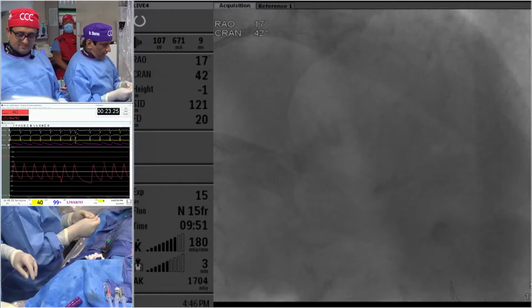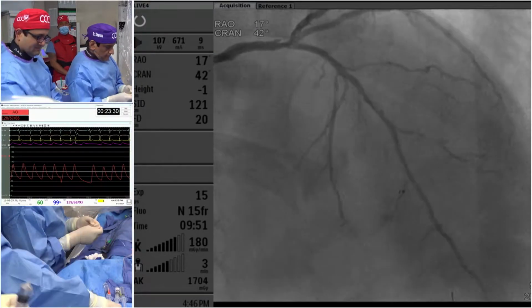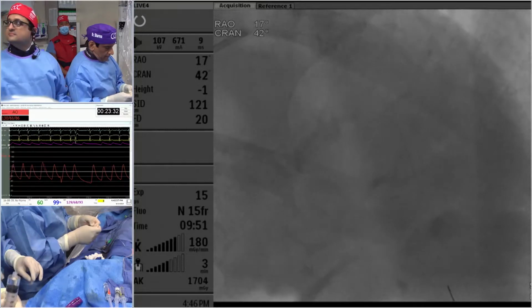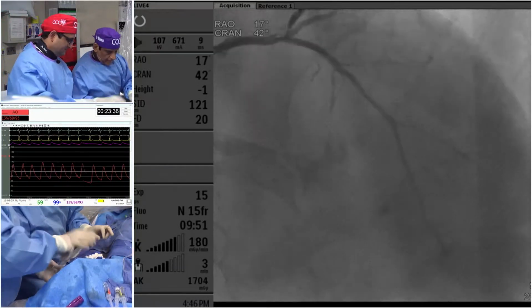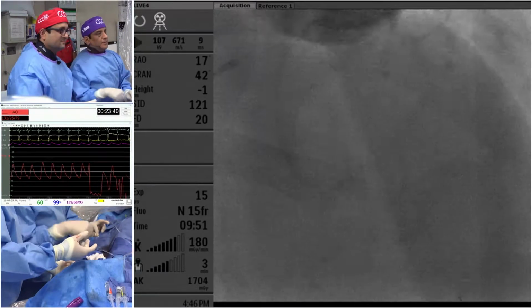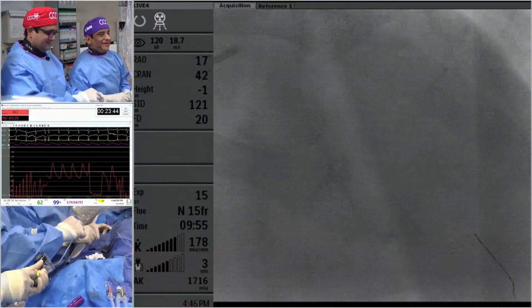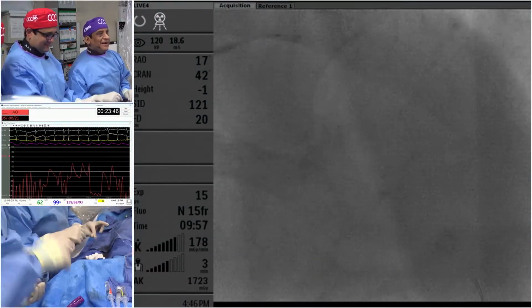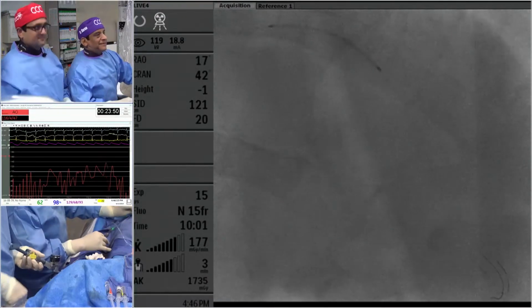What about case number 12? Is there any news from the room? This will be Dr. Kinney? Yes. That's the last one left, with a total occlusion patient, so that we complete all the cycles. And that also is very calcified. So today the symposium was complex coronary cases done by atherectomy, 100%.